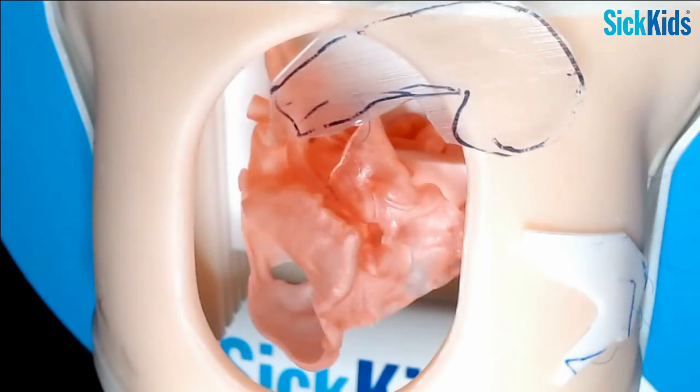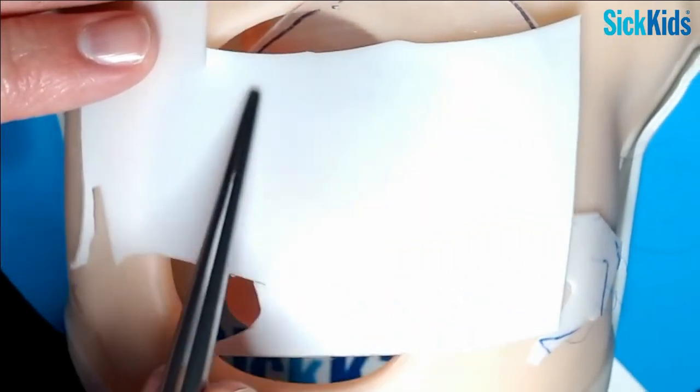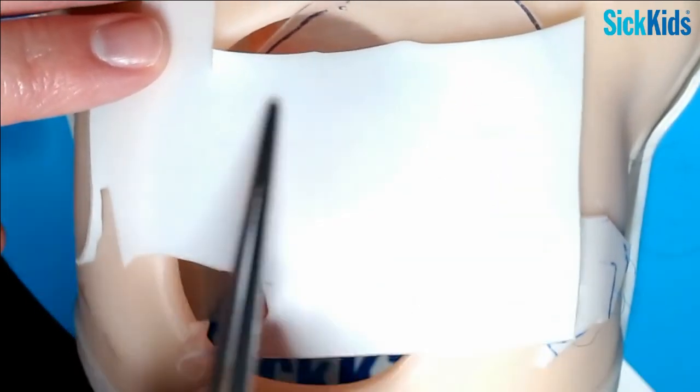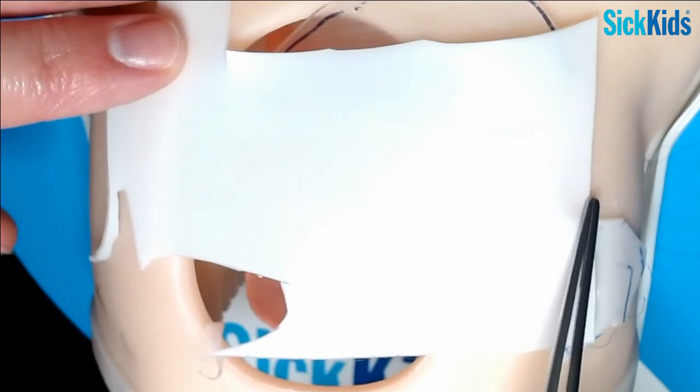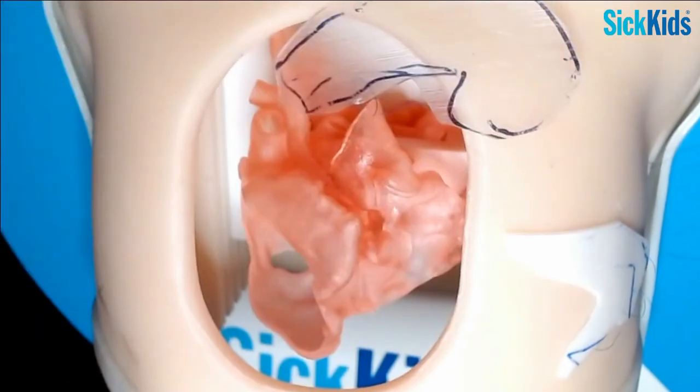All right? Great. So just to remind you, the most important point probably is making sure your outer curve is long enough. It's really long compared to what you think it's going to be. So whatever that left-hand curve is, that's the long one. The other side you can shorten and make it as you go.